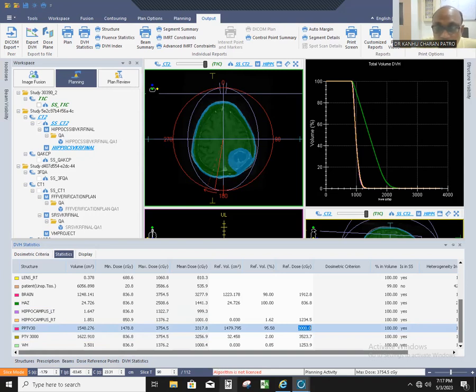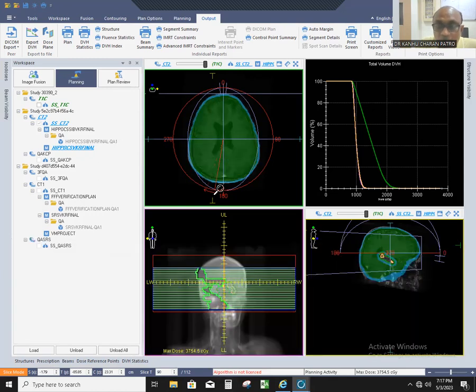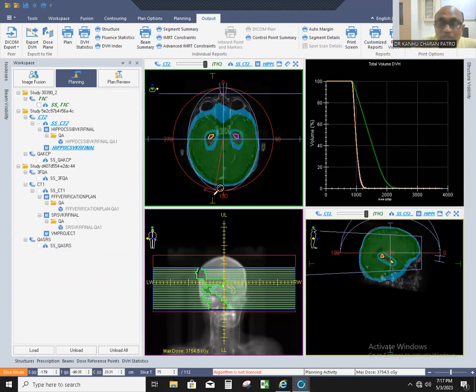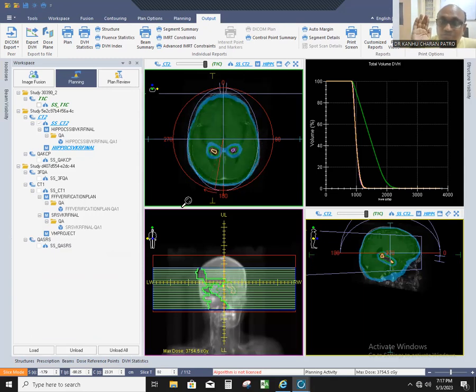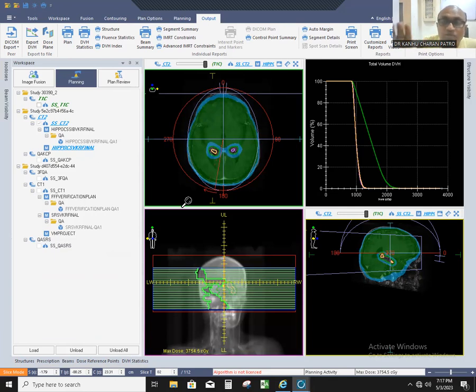For the PTV, maximum dose is 37 Gy, mean is 32 Gy, and 30 Gy covers 95.58% of the volume — meeting the protocol requirements. Remember the four key landmarks: temporal horn, posteromedial part, quadrigeminal cistern, and the superior part of the quadrigeminal cistern as the last slice, going from bottom to top. Thank you very much.